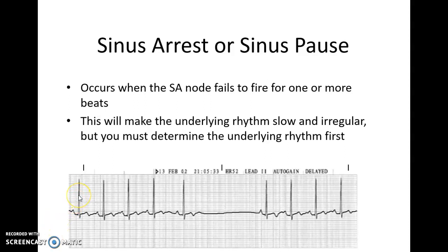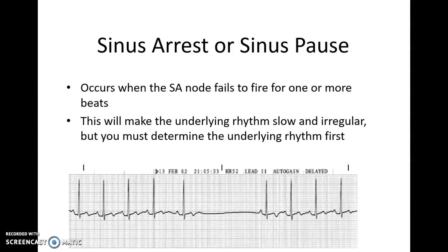Looking at this strip, I see R to R to R to R — it looks regular. This one here started to slow down just a little bit, and then it looks like I'm missing one or two beats. Then it picks right back up and my R to R to R becomes regular again. This particular pause is going to make my rhythm a little slower, but looking at the rate before the pause, even from this six-second strip I would have had at least a rate of 80, if not higher. So I would call this a sinus rhythm with a sinus pause.